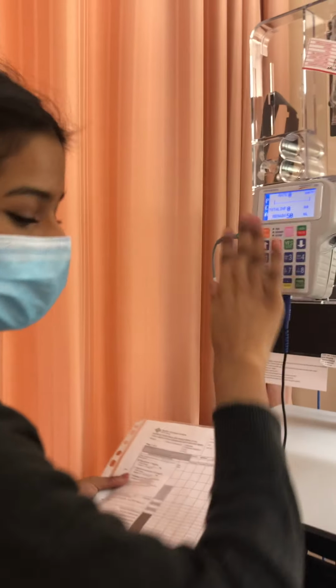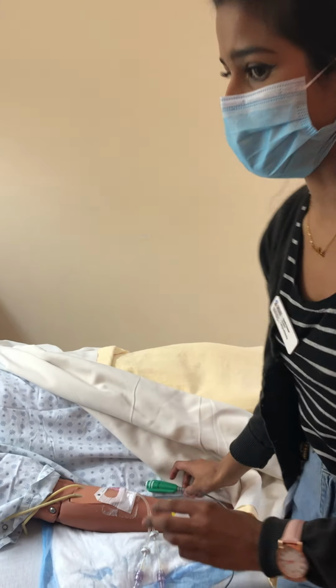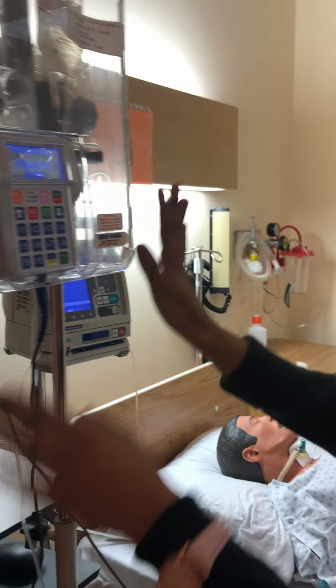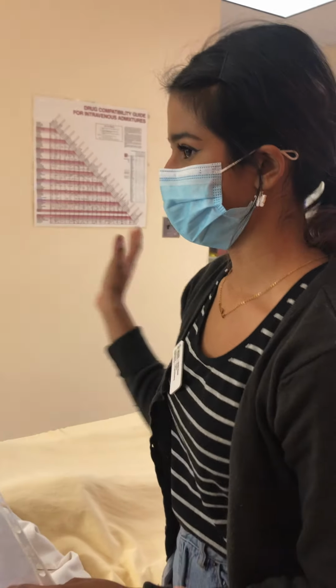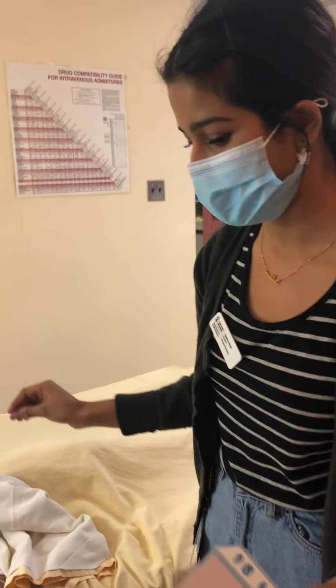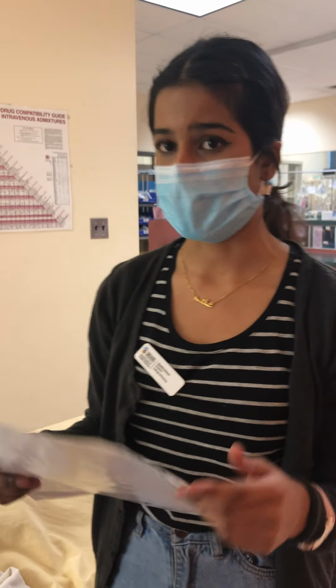So the light is flashing over here. We can tell the medication's running. I'll tell the patient, this is your PCA bolus, PCA button. So every time you press this button, you're going to get a bolus of 1 milligram. And I'm going to lock the pump. So I'm going to close the pump and make sure it's locked so that no one else can come in and program it. And I'll make sure that I review the vitals with the patient, so I come back and check on them, and their call bell is in their reach, they're lowered to the ground, everything's good, and I'll go ahead and sign my MAR.